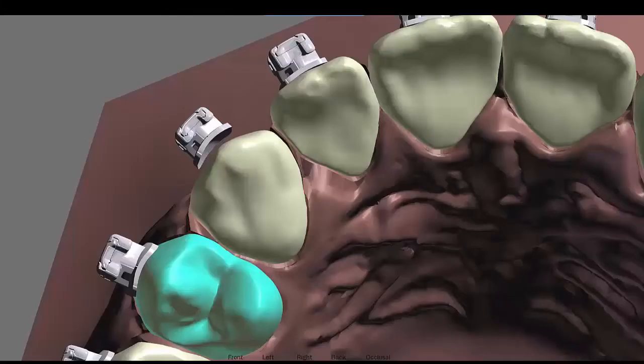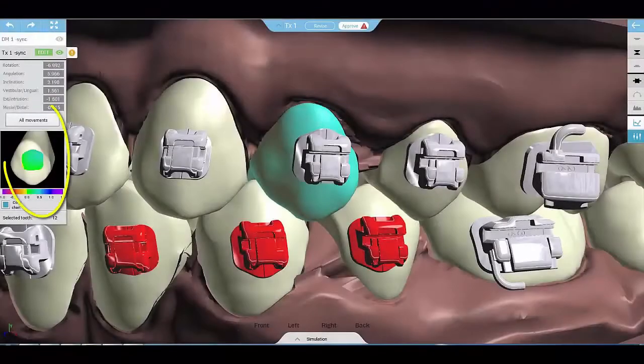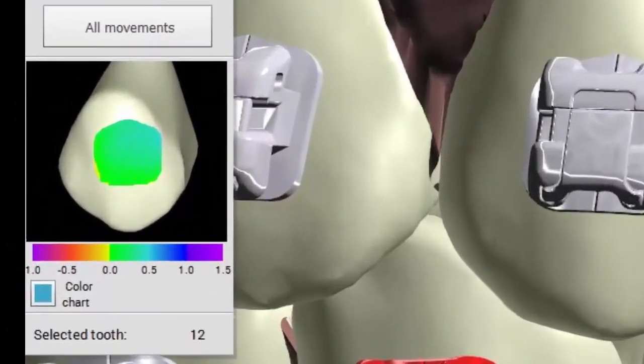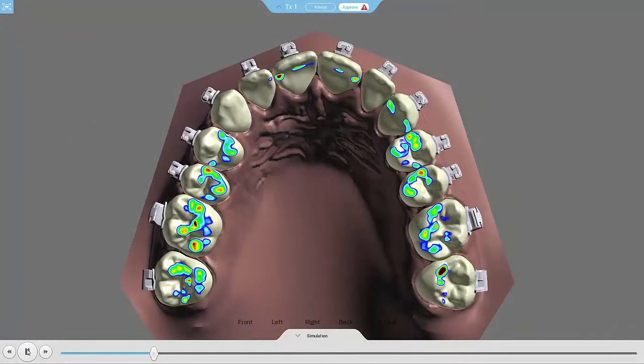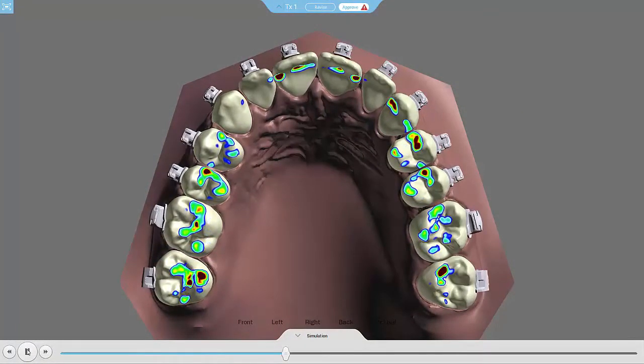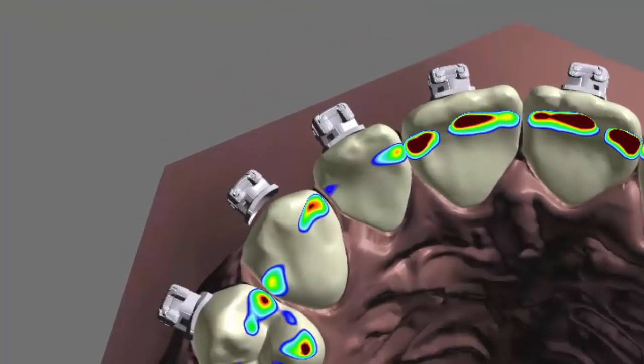XSEED offers two types of bonding protocols: clean and pad-adjusted. In the first type, the bracket pad is positioned at a distance of 0.1 mm from the tooth, and that space will later be filled once the adhesive is applied. The second protocol, pad-adjusted bonding, is employed only in XSEED TX orders whenever the effective bracket torque has to be corrected to produce a desired post-treatment outcome.